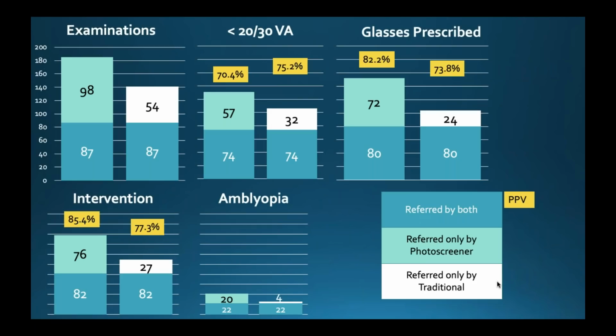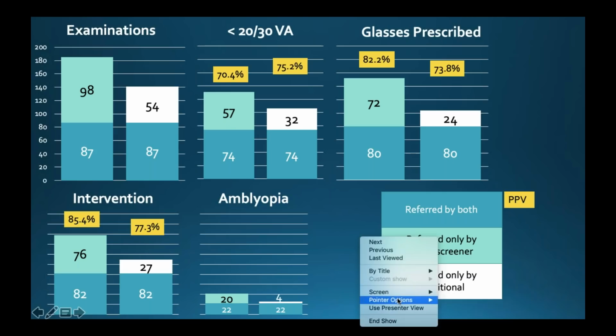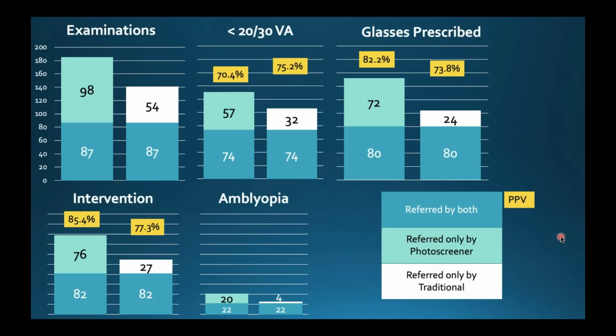So you look at this summary of all the information, and if you are screening by both methods, then you get to stack everything. You get to add this 32 to this 57, add this to here. I think picking one or the other is an okay thing to do. I do not think you need to do both.